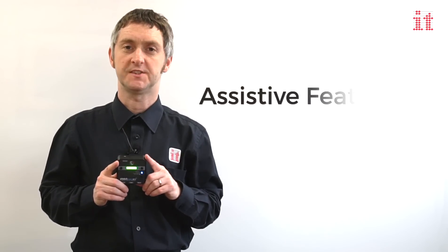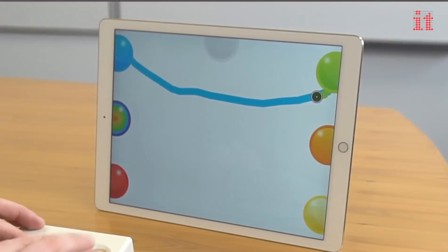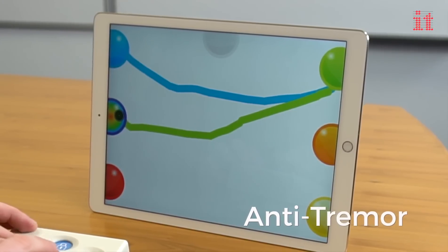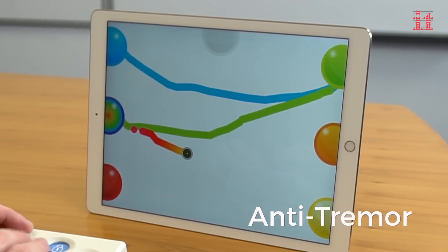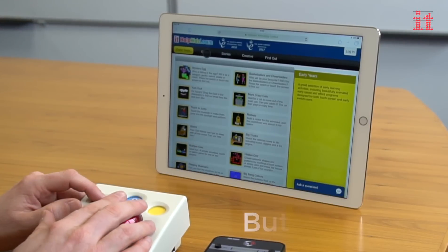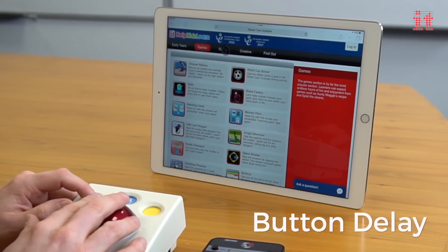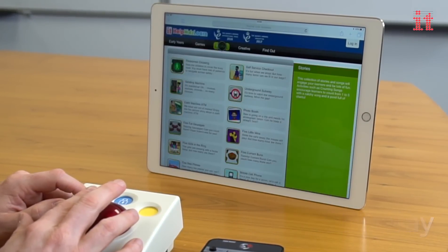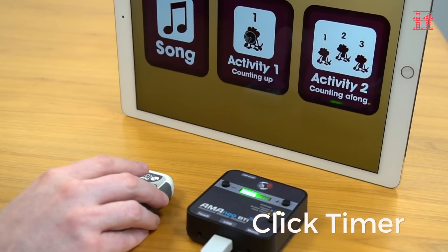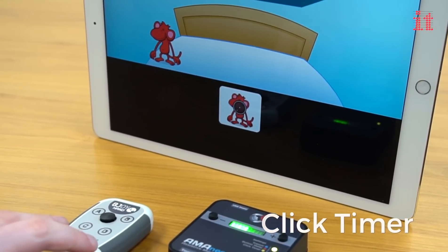Users with a physical disability can also benefit from several additional features. An anti-tremor function electronically filters the shaking of the hand or head so that the on-screen touch pointer moves smoothly. By enabling the button delay feature, mouse clicks will only activate after a set amount of time has passed. The click timer function activates the left click automatically if the mouse remains at the same point for a set amount of time.